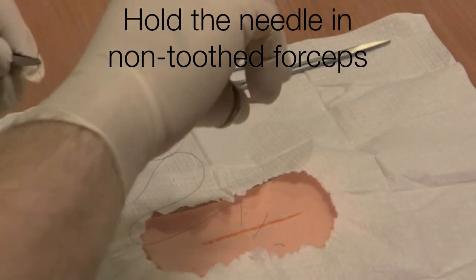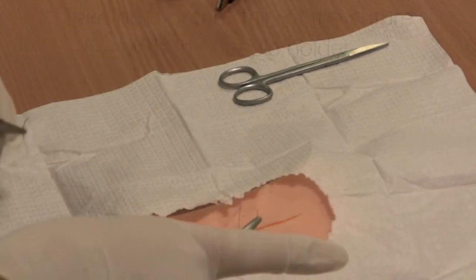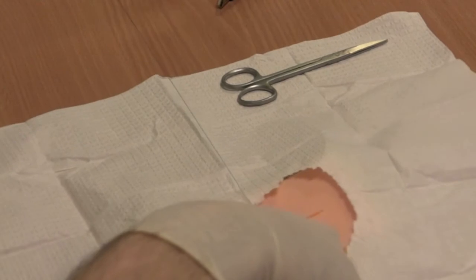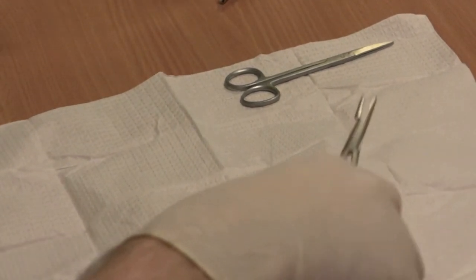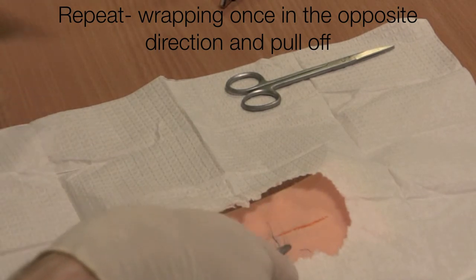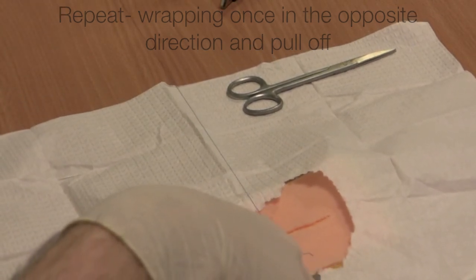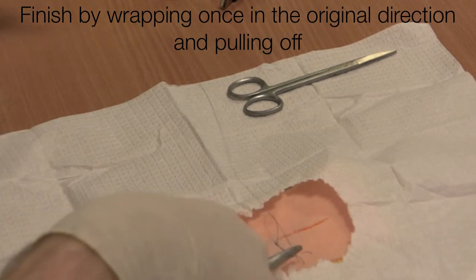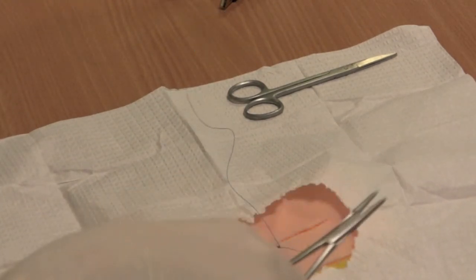Wrap the thread around the needle holder twice in one direction, grab the end and pull. Wrap once in the opposite direction, grab the end and pull. And then back in the original direction, wrap around once and pull. That completes your knot.